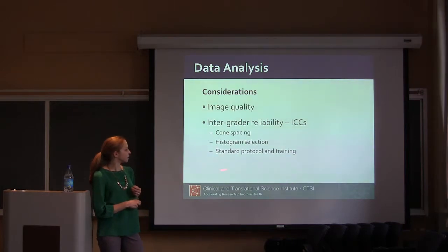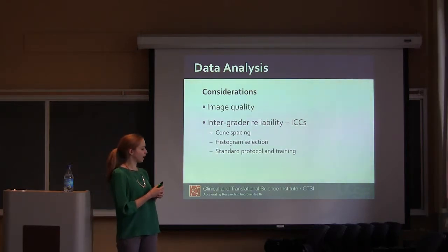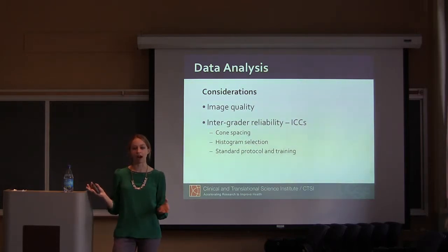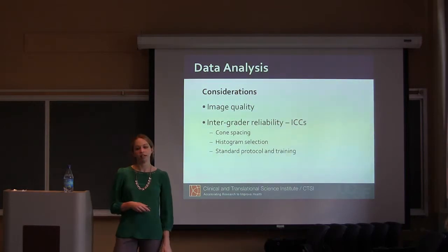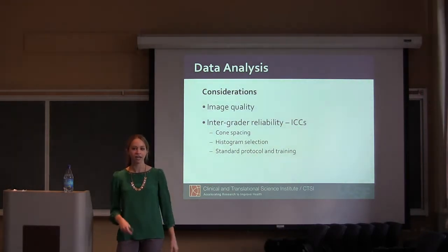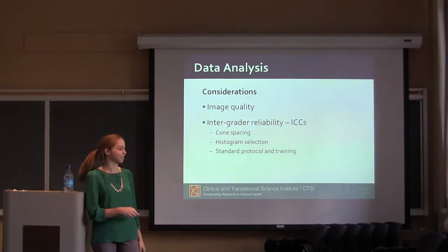One of the things we've tried to think about is having a training protocol, getting at Krista's question of people getting better the more they do. What we'd ideally like to do is have people complete a certain number of practice images before they're allowed to grade data from the study. In the real world, we'd have them do a whole bunch before becoming a qualified grader. At this point, we're working under a tight timeline, so we'll have to balance those two things.